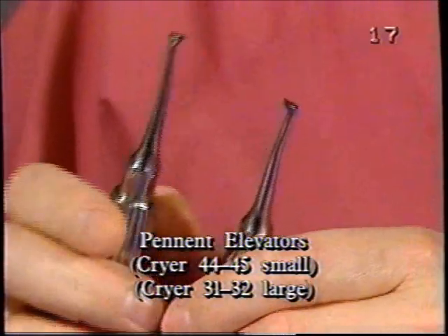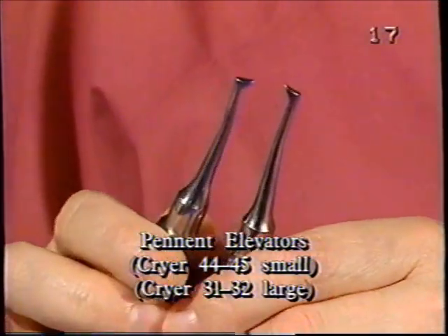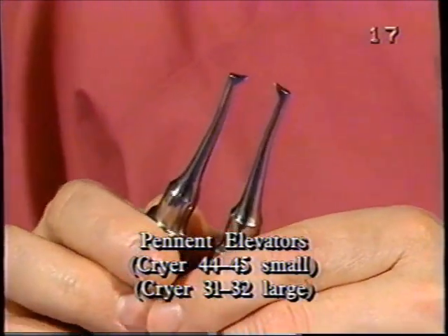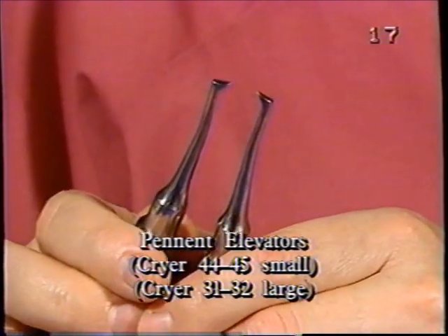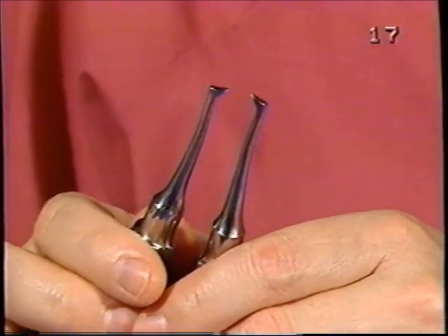Next we have criers. Now, as I've mentioned, crier elevators, east-west, flag, pennant, whatever you want to call them, they're indispensable for surgery. I need them for all difficult cases.